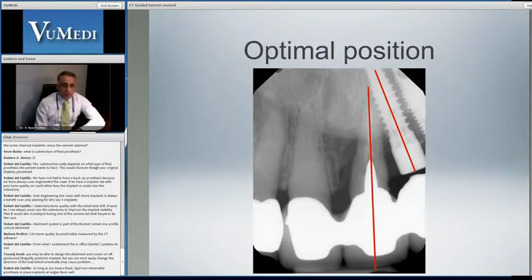The next very obvious benefit during the planning of our implant cases using a CT-guided approach is to avoid this kind of problem. There's no reason nowadays to have any implants not perfectly placed to receive a restoration and to achieve the kind of results that we're looking for.